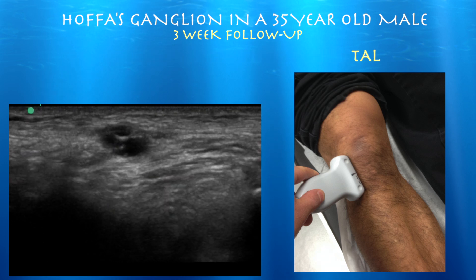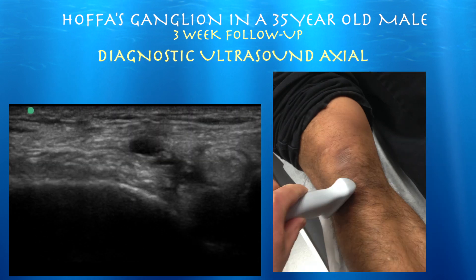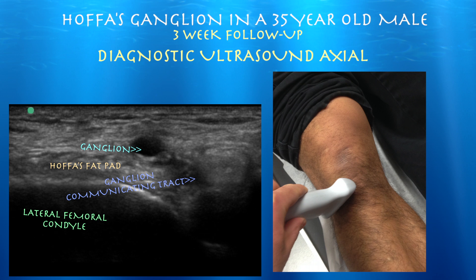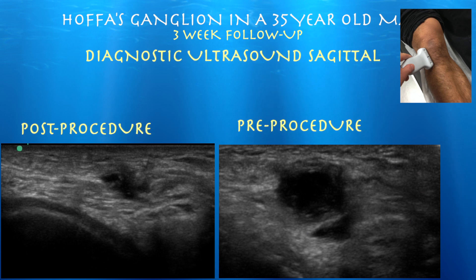Here we are in a sagittal view, and now following up with an axial view. There's the ganglion at about half its prior size. You can still see a communicating track. Here are our pre- and post-procedure comparison views, and you can see a significant decrease in size.